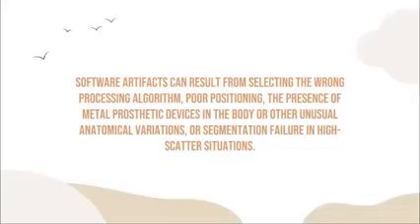So many CR systems use partitioned pattern recognition software to scan across the plate and determine the number and orientation of views on one plate. A process also called segmentation. So, dali na itong sulutong sa segmentation.